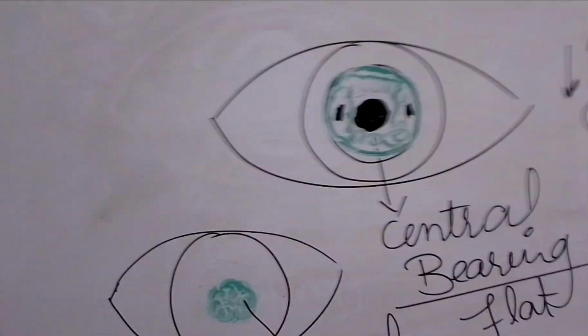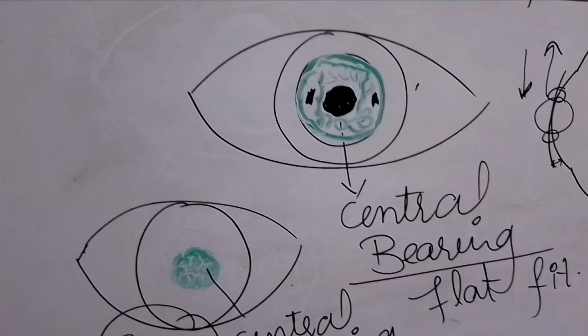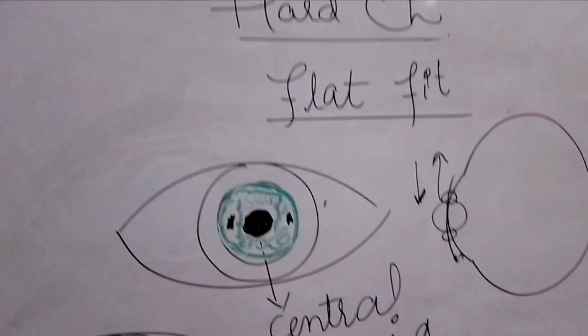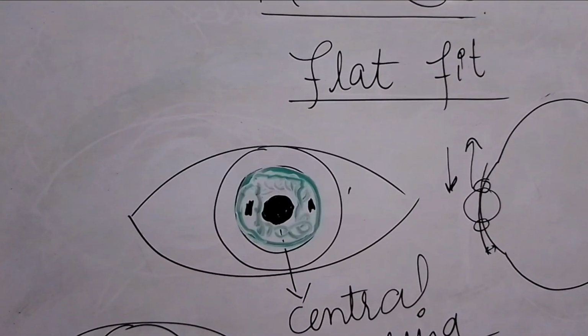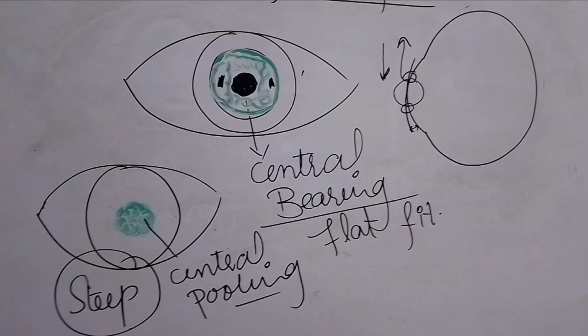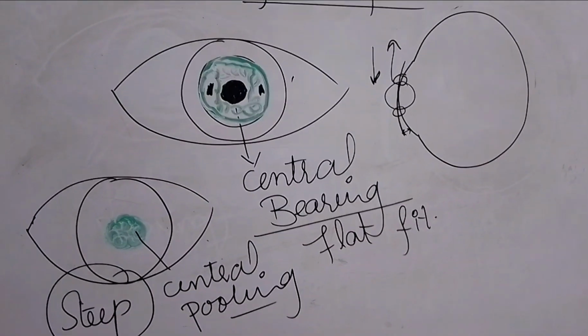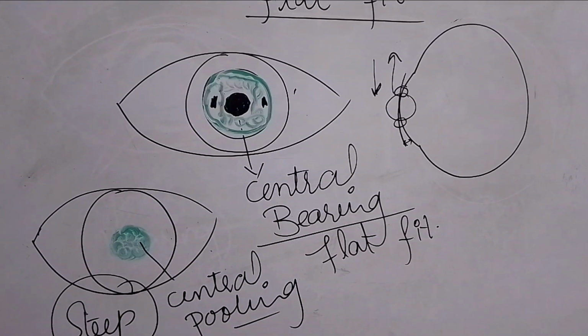This is the flat fit and this is the steep fit, and how the ideal fit appears I have discussed already. I hope this is now very clear to you all.